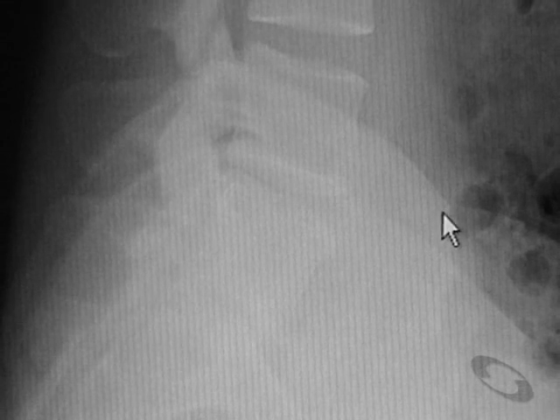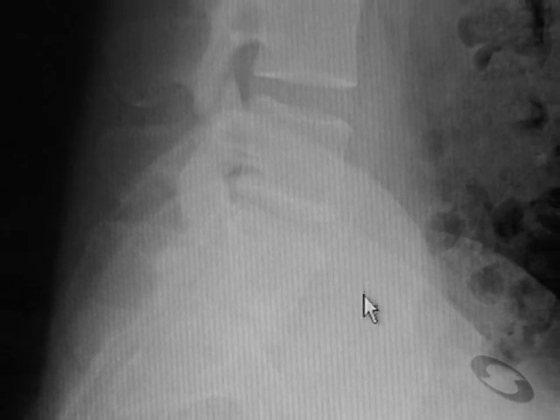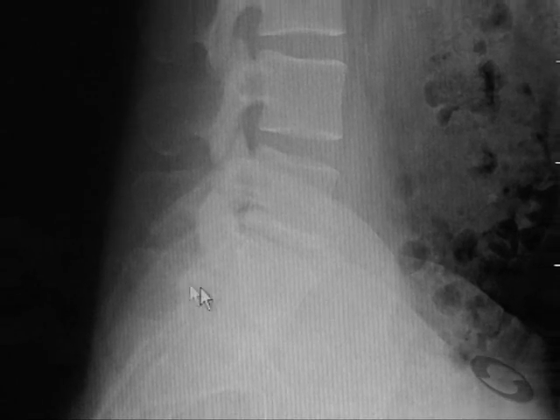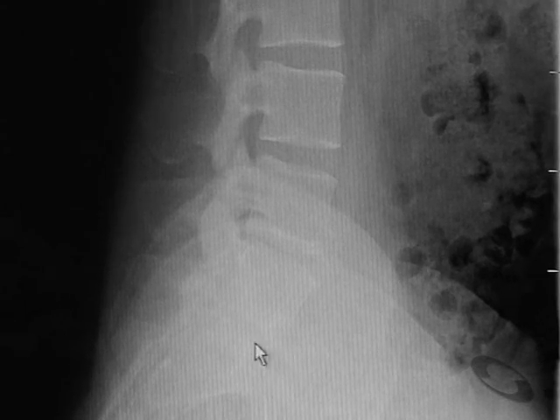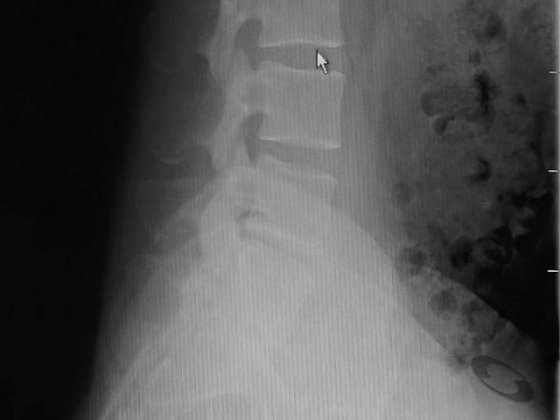These are the preoperative plain x-rays on the patient on whom we're going to operate. This is the abdominal contents. This is anterior, posterior. This is the vestigial disc space that we'll see on the MRI scan that we labeled S1, S2. This is where we've labeled this L5-S1. The normal disc height we can determine from the L3-4 and L4-5 interspaces.